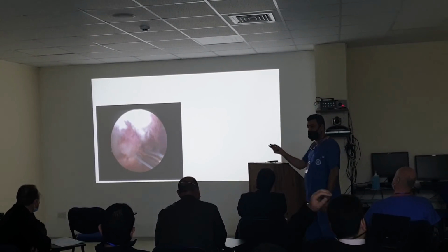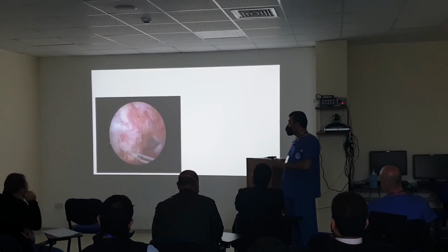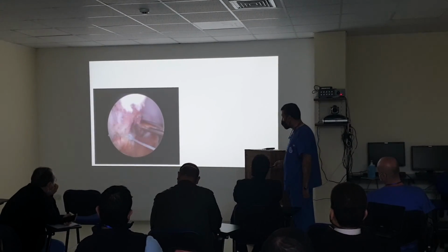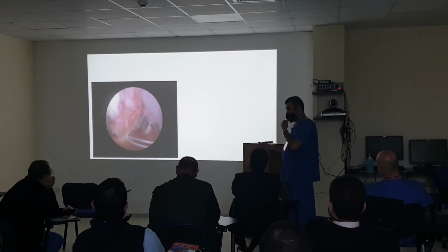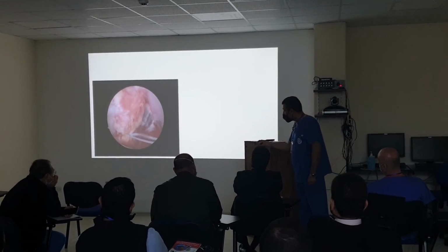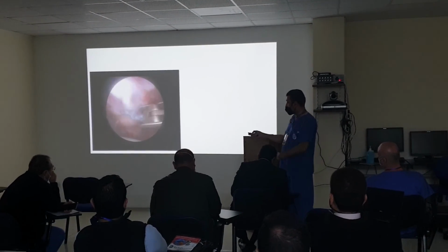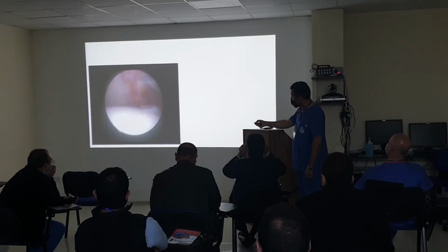And I think in the workshop, we will show you how to make a good tying technique, because we want the loop security and the knot security, because we want this stable after finishing our surgery. And how to make, which is the post and how to switch the post, because the post is the one you put it. So we want the knot on the outer side first. We want the knot on the outer side, not on the cartilage side. And here when you finish the other anchors, you see the final design.